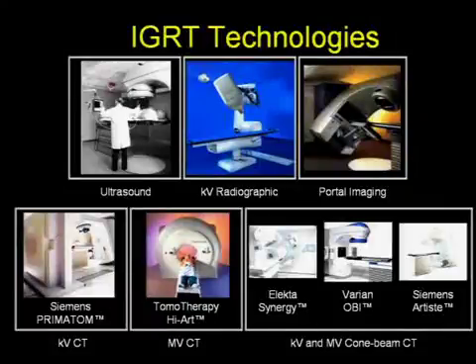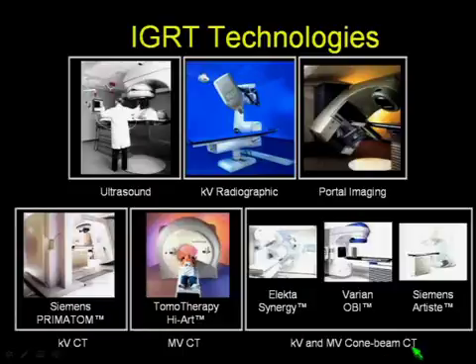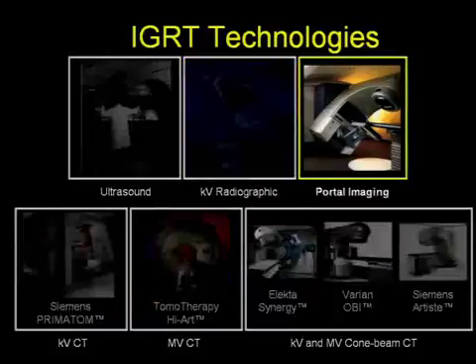So here is a slide that shows several of the commercial implementations of IGRT technologies, going from ultrasound to two-dimensional kilovoltage imaging, portal imaging, as well as the CT-based technologies going from kVCT, MVCT, and cone beam CT technologies using either the treatment beam or kilovoltage X-ray tubes.